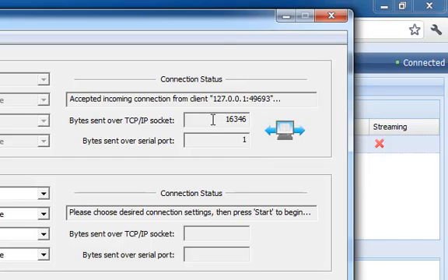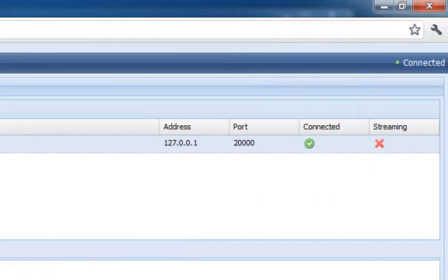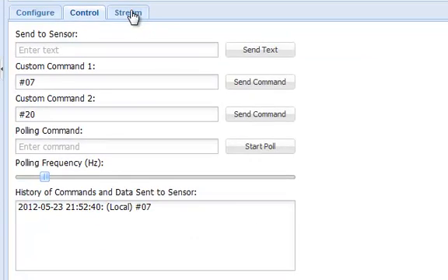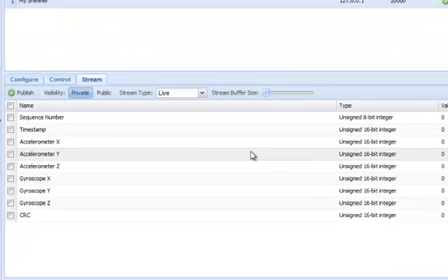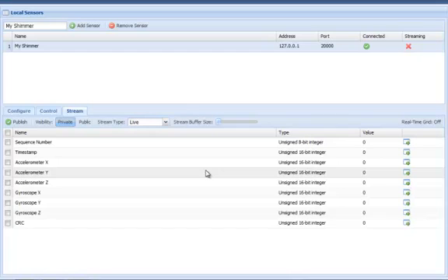By selecting the Stream tab, I can visualize any of the incoming variables by clicking the graph icon to the right.